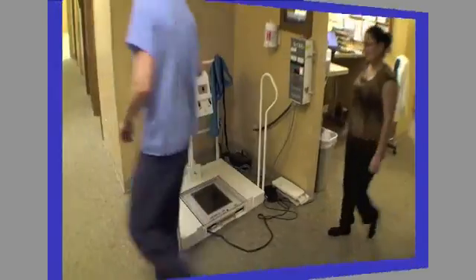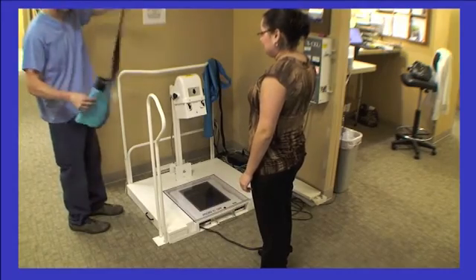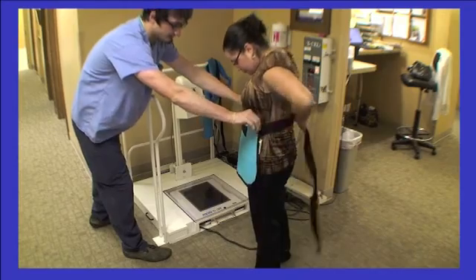Before any X-rays are taken, you will need to place the lead apron on each patient. This is a gonadal shield to protect the patient's sexual organs from any type of radiation.